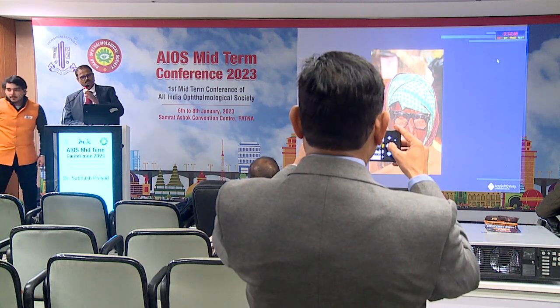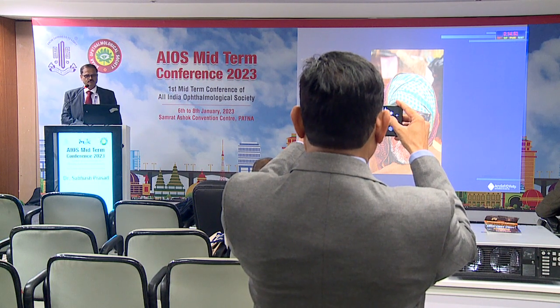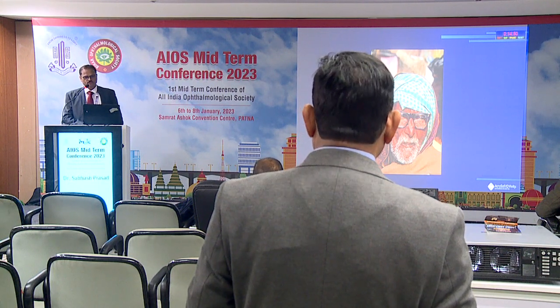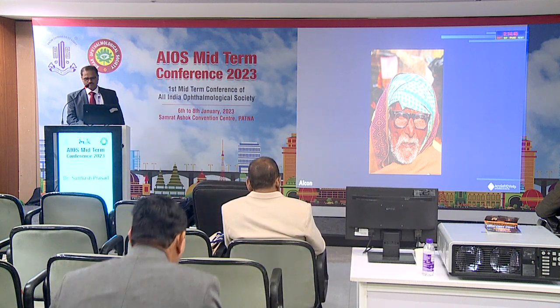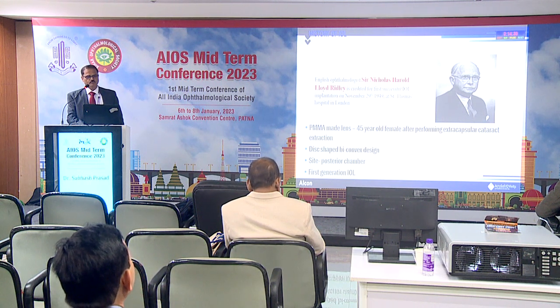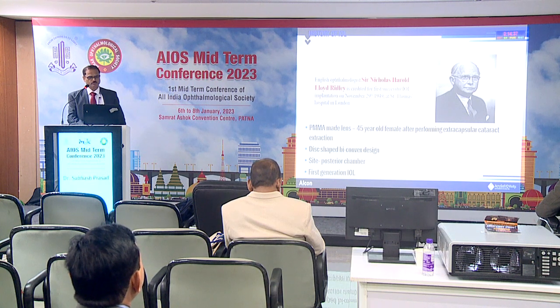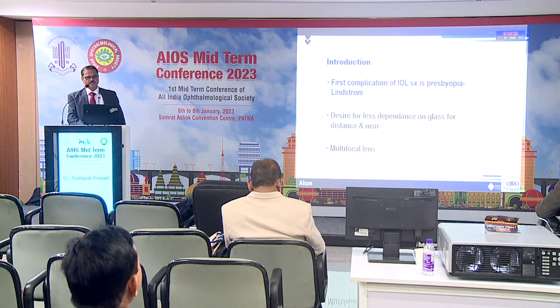So good afternoon. Gone are the days when we used to have cataract surgery for these types of patients who used to wear very thick glasses. After that, once the intraocular lens came, it was all because of this gentleman, Harold Ridley, who first implanted the IOL in 1949. But the first complication of IOL surgery is presbyopia.